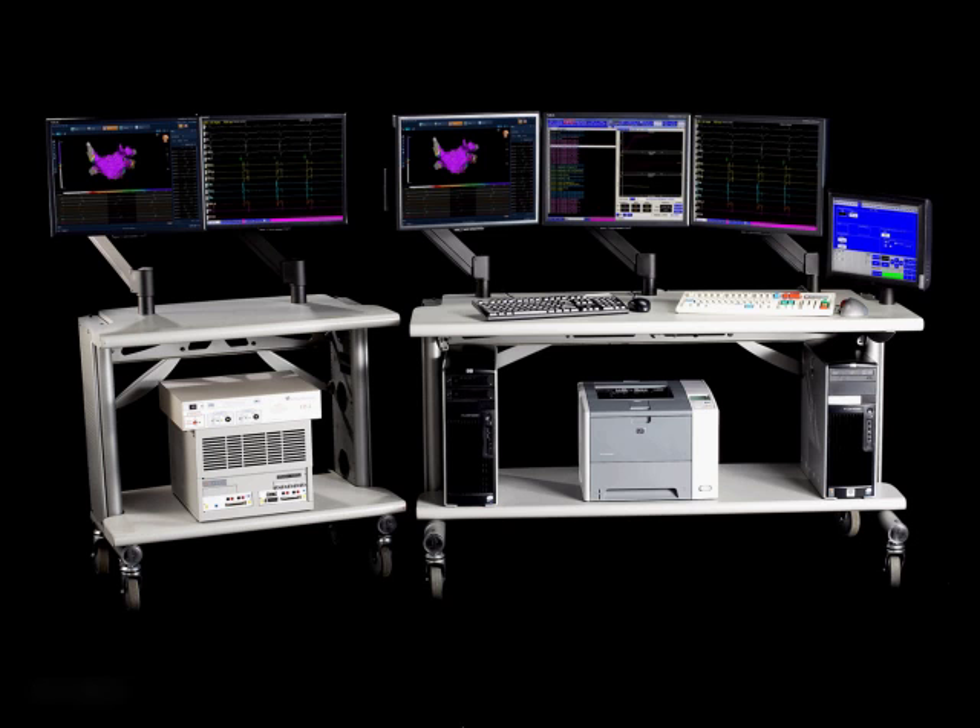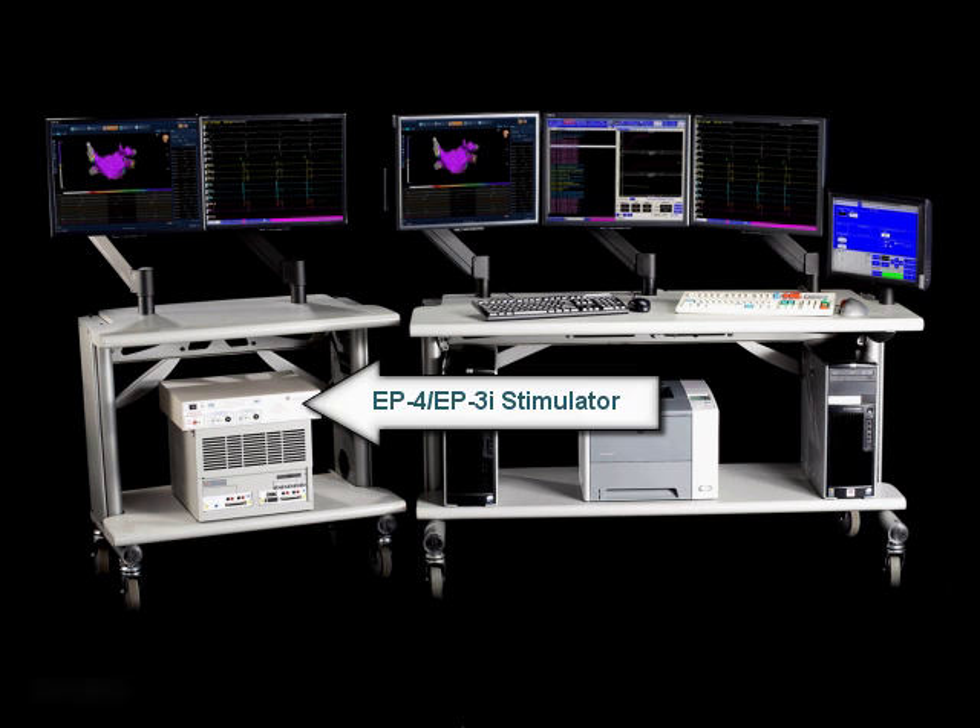The main computer then adds all the signal attributes and filtering and displays them on the screen. EP Workmate Recording Systems also include an integrated EP4 cardiac stimulator and EP4 cardiac stimulator touch screen control.